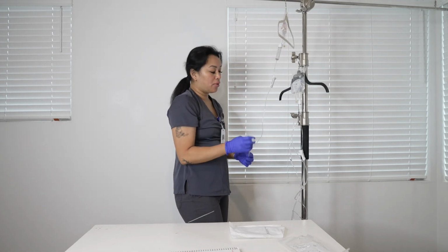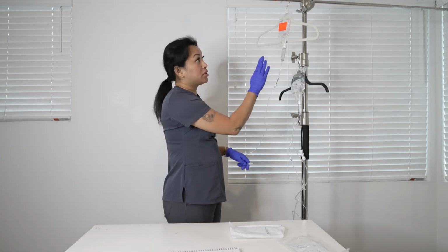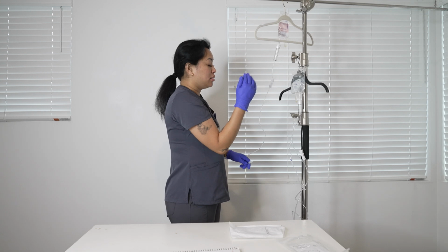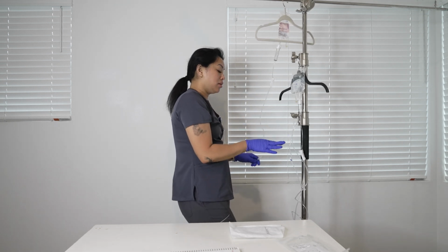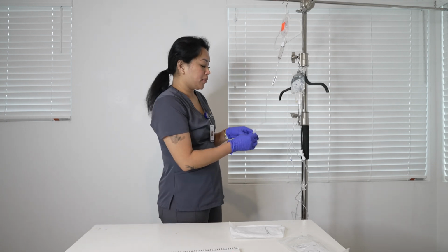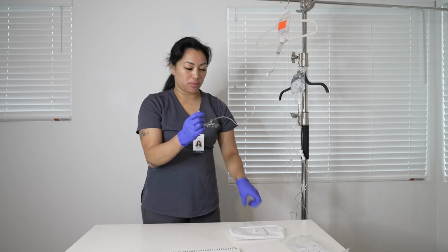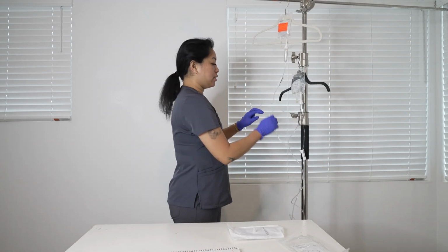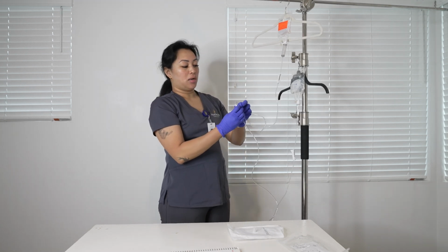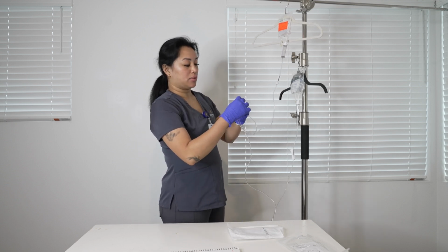So now I am going to attach the medication, the amoxicillin, to the fluid. So in order to do that, I have to uncap the cap from the secondary tubing, hold that, and now I am going to, I am not going to do it.